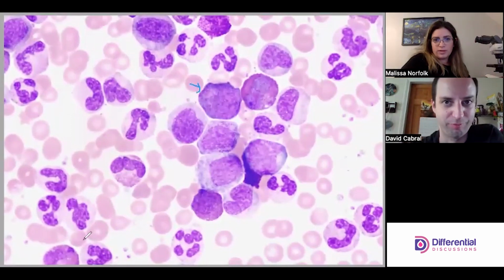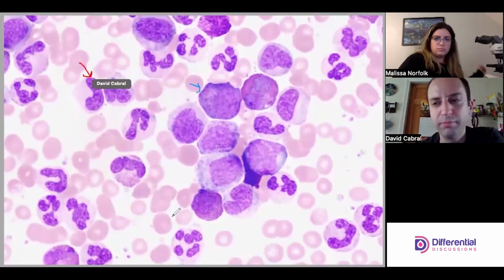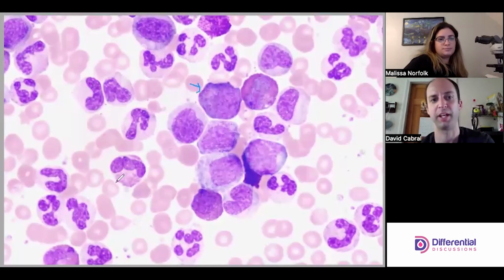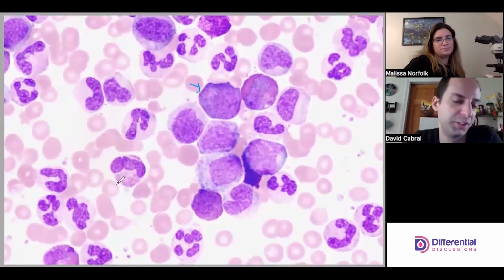What are you showing me, like for a band? Hold on. Here, see. So what I see here doesn't pass my smell test for a band, but I will acknowledge that the nucleus looks rounder and there's less twisty lobe formation.